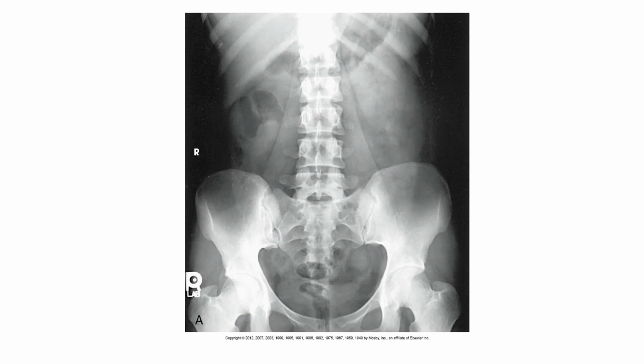The other kidney bean shape, or the other kidney, all right, so there's a giant air bubble in the middle of the right kidney. I think everyone can see that, okay? If you start with a small letter R and you go straight over horizontal, that intersects the bottom of the kidney, okay? Go up and it kind of looks like a horseshoe shape, or maybe a helmet, like a cracked helmet shape, this air bubble that I'm talking about. Y'all see that? That kind of looks like a cracked helmet, like a helmet got split or something.